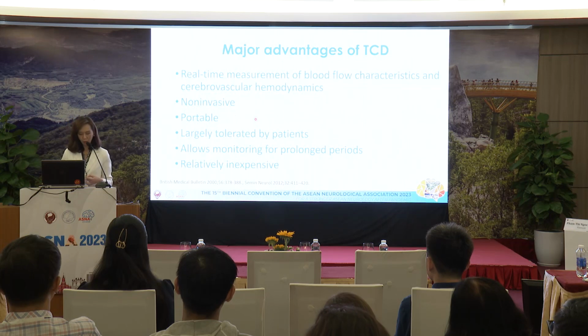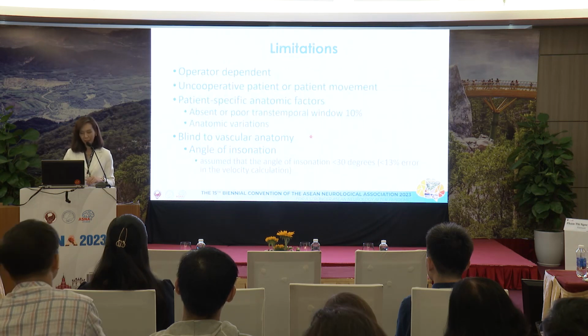We can move it around. I think it's very highly tolerated by patients. You can just put the probe in, and there's no harm or anything. It's not painful, so it's tolerable, and relatively inexpensive.